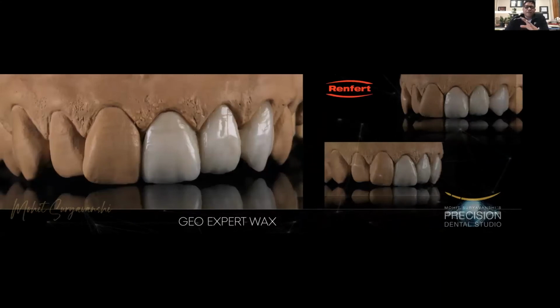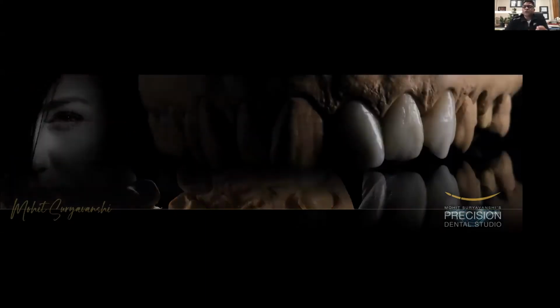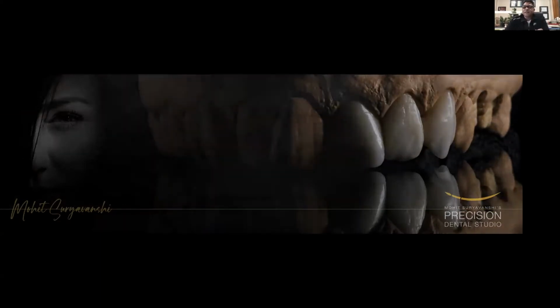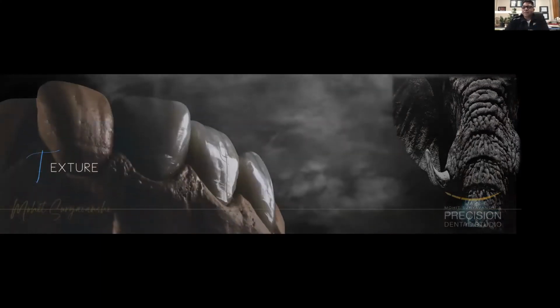Okay, every natural tooth. These are a few things wherein we try to manage the shape, we try to achieve the color also, we try to also study the texture on this, all aspects. So rather than proceeding straight away to the ceramics, it's a nice experience that you could do with this wax. Absolute true to life aesthetics you can achieve. The best thing about this wax is that it is reasonably priced compared to ceramics.